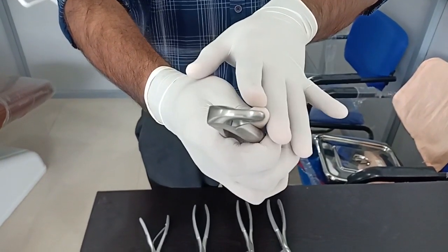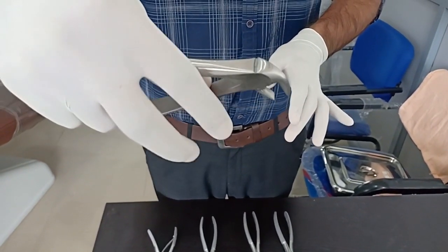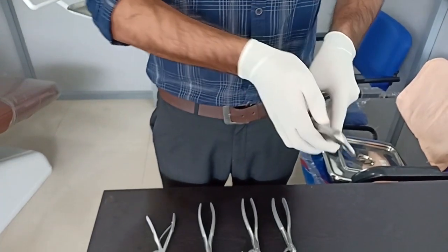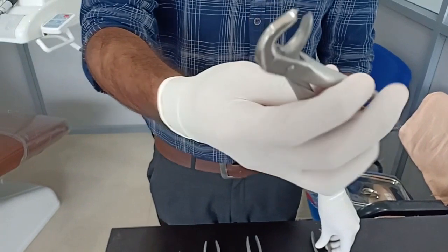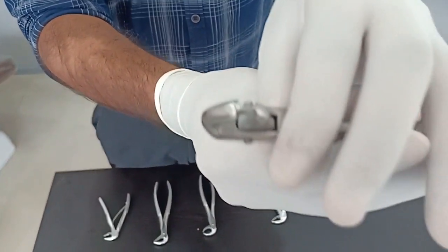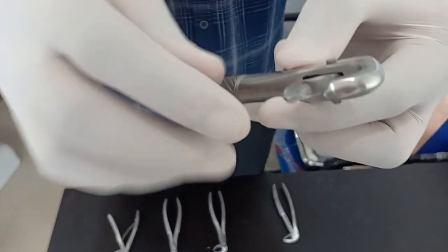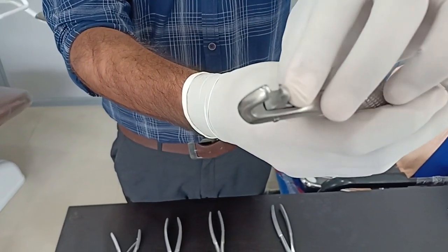There is no right or left premolar forceps, so you can do all the anterior and premolar tooth extractions using the same forceps. The next one is the molar forceps. You can see the beaks — here the beaks are similar on both sides, and there is no right and left mandibular molar forceps.